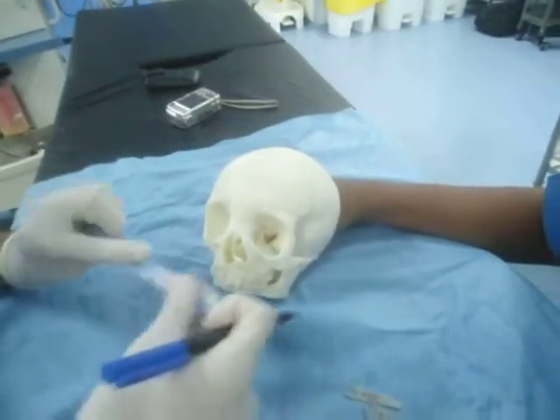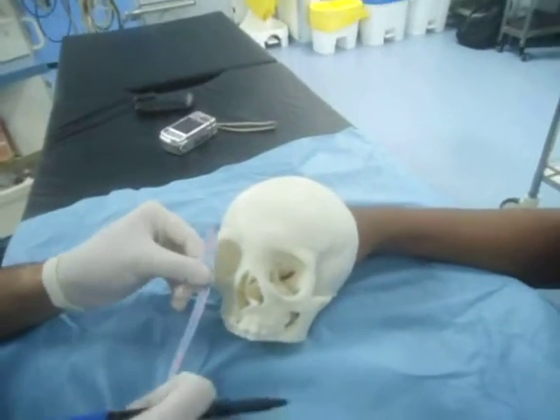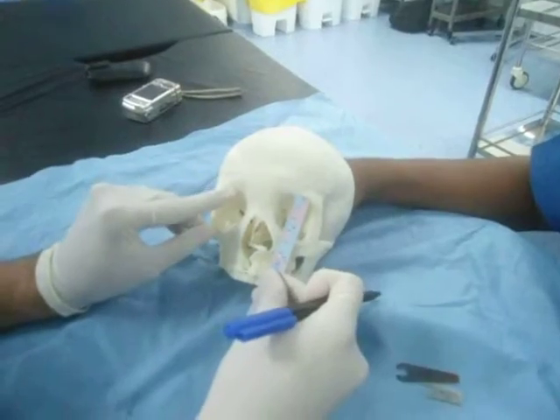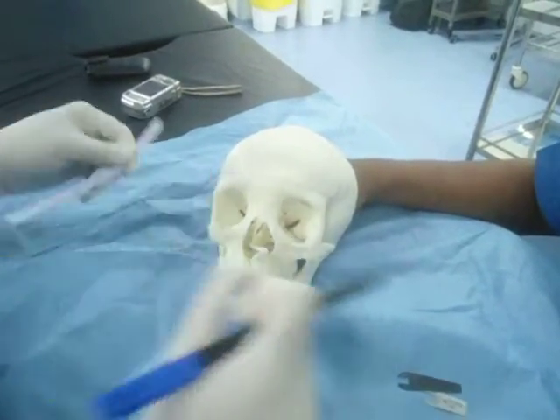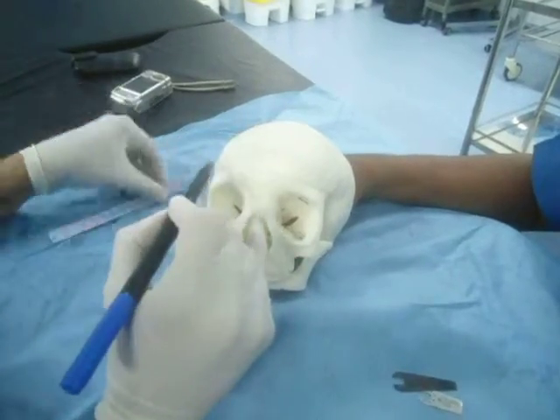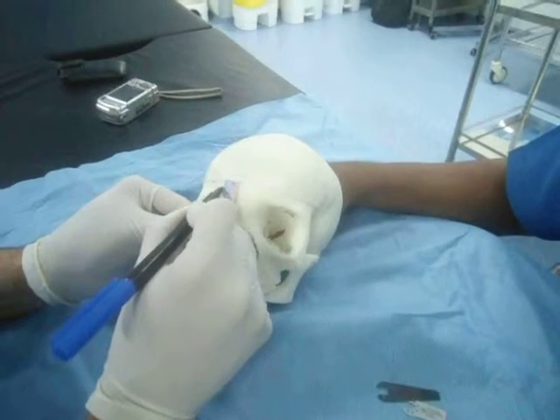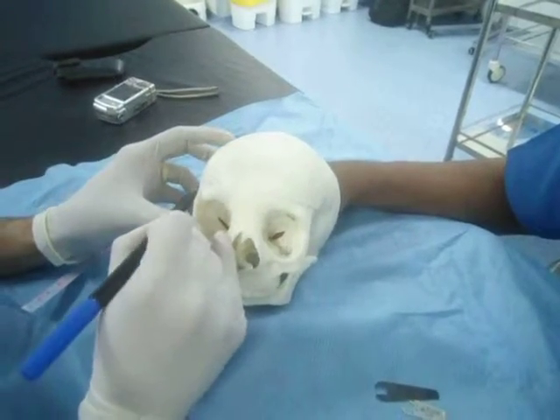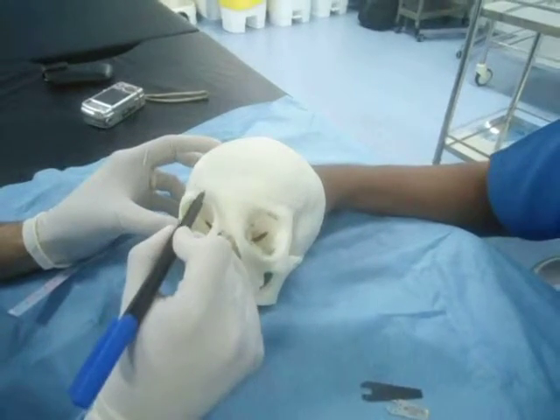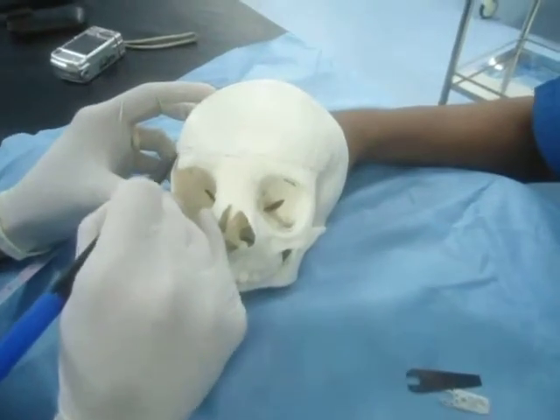Now if you look carefully, this orbit is about half a centimeter lower than its counterpart. So we will design the osteotomies in such a way that will level the cuts. So we need to resect about half a centimeter of bone here.